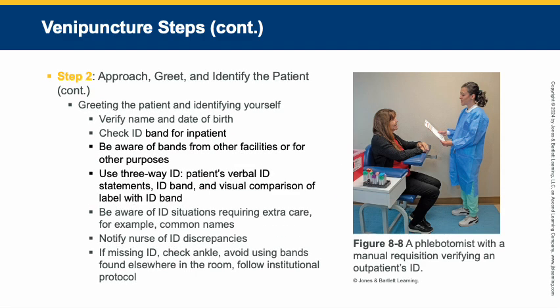If you greet the patient, you're going to verify their name and their date of birth. Check the ID band for an inpatient. If it's an outpatient, they still usually have the ID band. Be aware of bands from other facilities or for other purposes. Like if they got transferred in, make sure you're not matching it up with a barcode on a band they have maybe from another hospital and you just didn't realize they haven't cut it off yet.